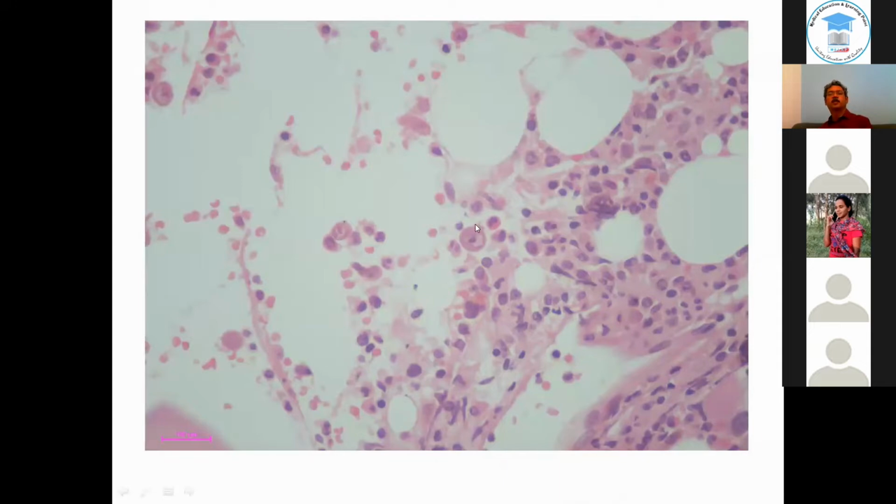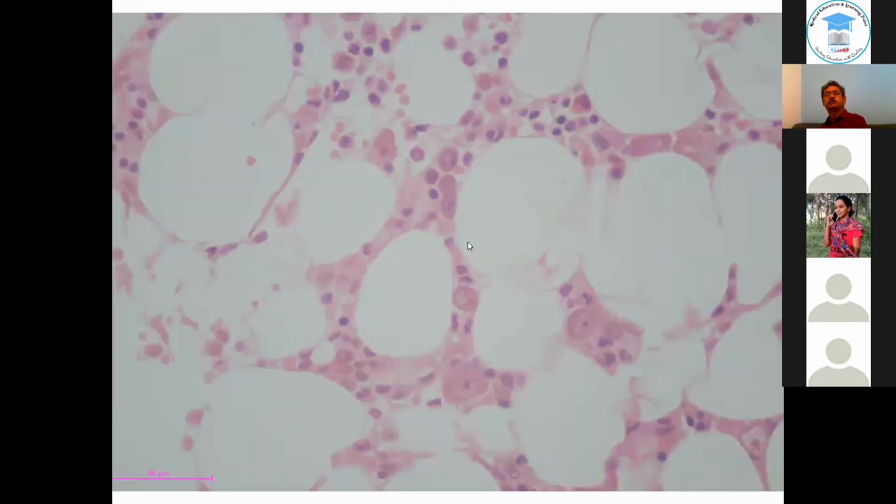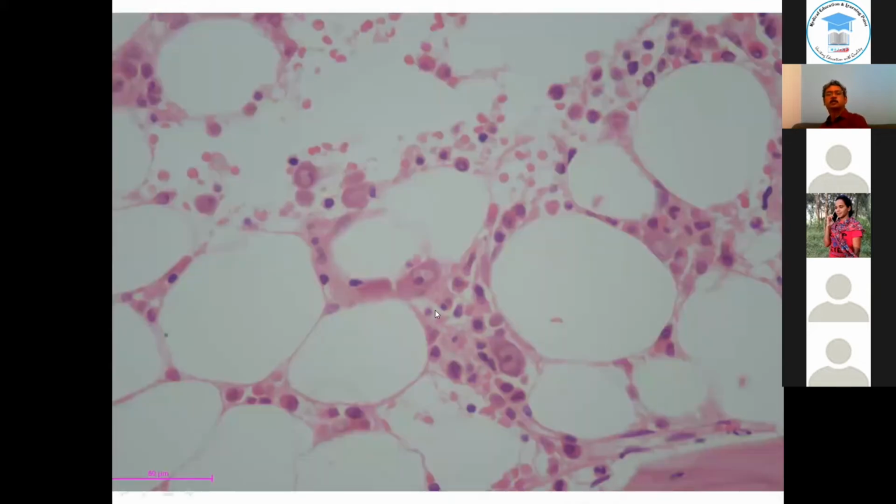And on a trephine at a low magnification, you can't see anything. But on a higher magnification, you can see this cell. One more here, and a prominent nucleolus. Higher power shows 3 of them out here, one more here, one here, one here. There are quite a few of them now, actually. You can't miss this. And because it is big, you shouldn't jump to the conclusion that it's cancer, because it just doesn't look like cancer. And there's abundant cytoplasm out here.